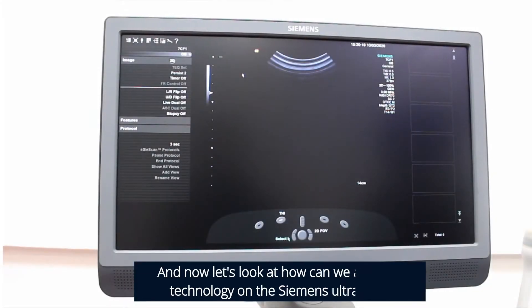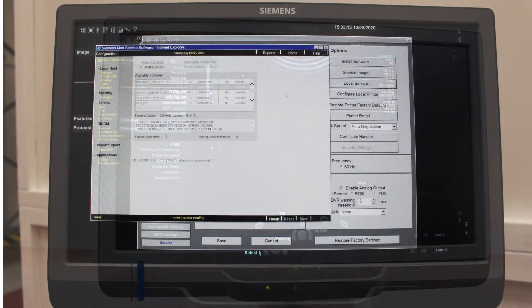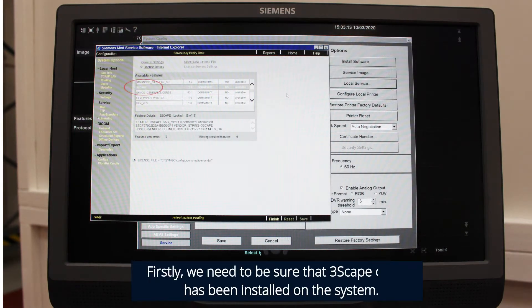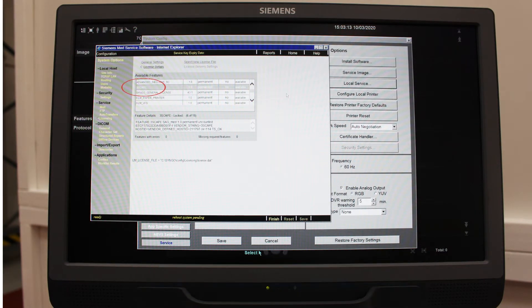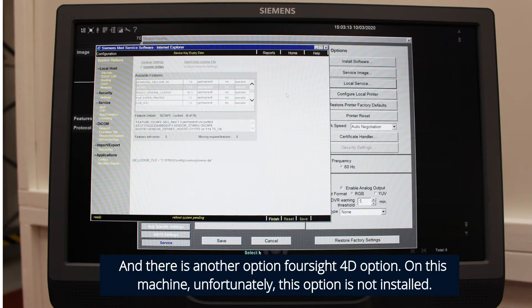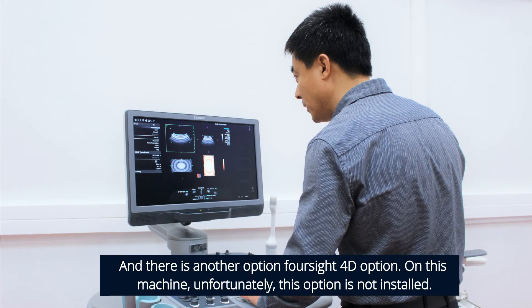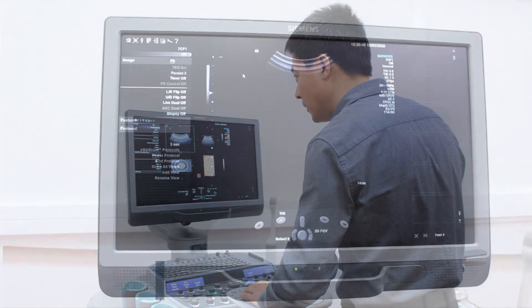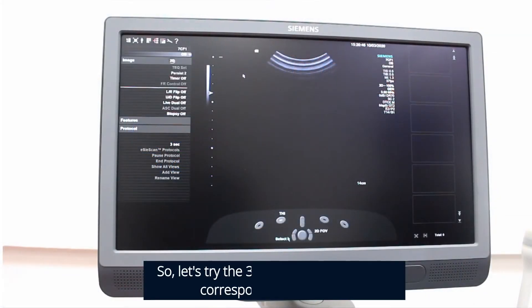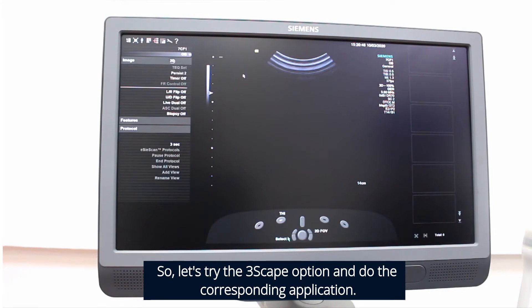Now let's look at how we can apply the technology on the Siemens system. First we need to be sure the 3Scape option has been installed on the system. On this machine, unfortunately the 4D option is not installed, so let's try the 3Scape option and do the corresponding application.